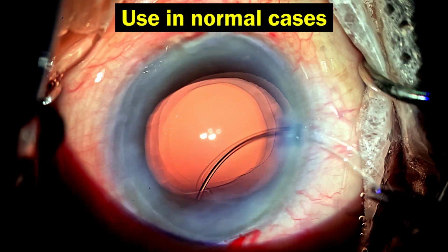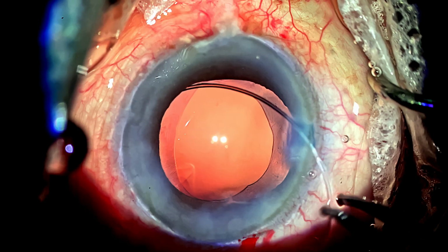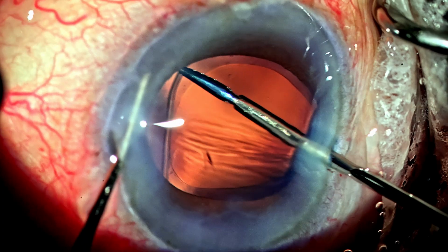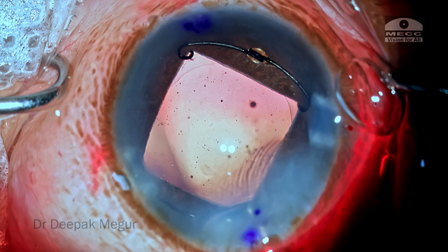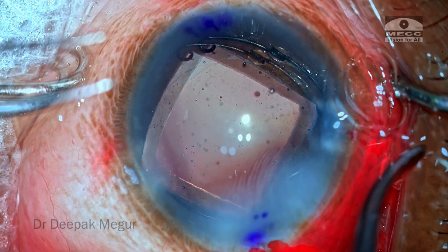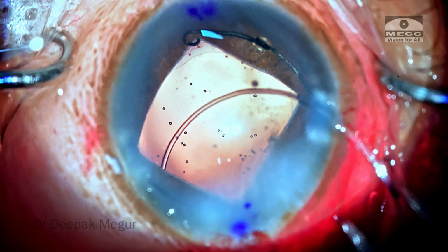So use it in a normal case, hold it, and you should be able to feel the consistency of this ring. And my recommendation would be to first begin to use it in some normal cases. How do I know that it's not gone into the sulcus and it's truly in the bag? Our goal is to place the ring into the bag. The one trick is to always keep the bag deeply inflated so that you have enough space to maneuver the CTR into the bag itself.